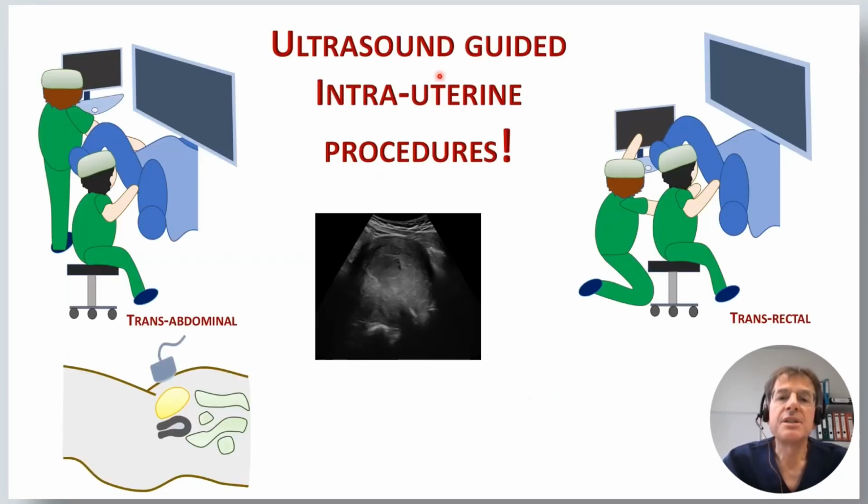And the ultrasound-guided intrauterine procedure, you can do it, usually we do it transabdominally, you fill the bladder to have a better view, and then you can see where you are in the uterus. You can also use the transrectal approach to do the ultrasound during the evacuation, but it's so important to do it under ultrasound guidance. Thank you very much.